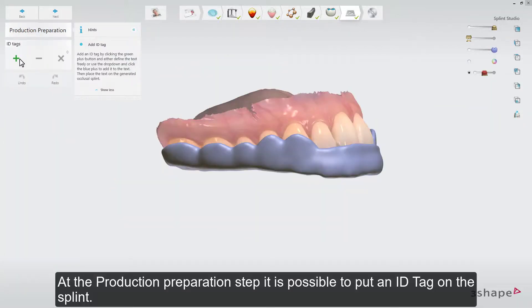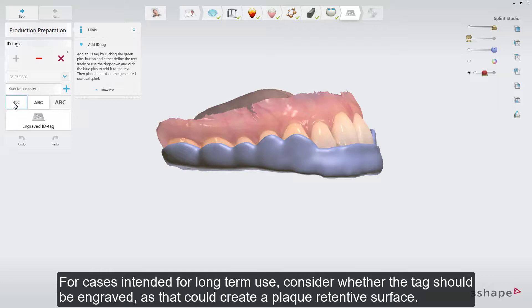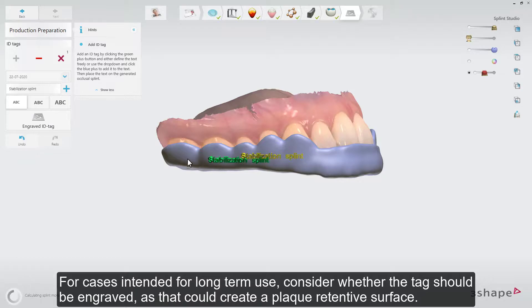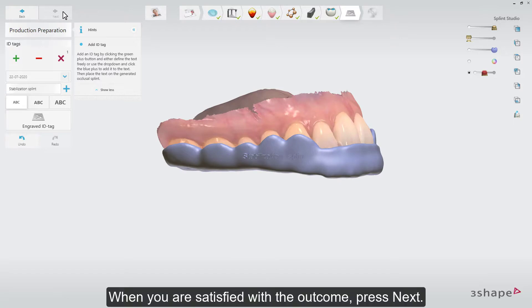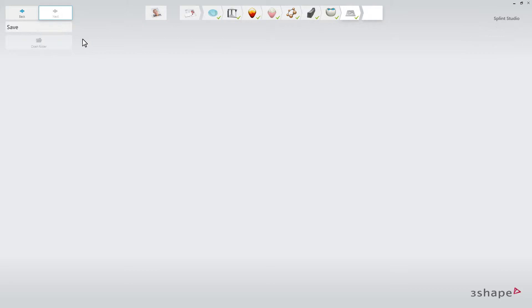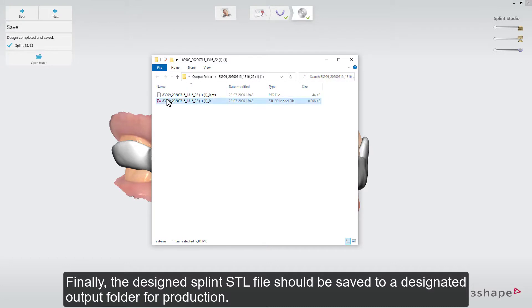At the Production Preparation step, it is possible to put an ID tag on the splint. For cases intended for long-term use, consider whether the tag should be engraved, as that could create a plaque-retentive surface. When you are satisfied with the outcome, press Next. Finally, the design splint .stl file should be saved to a designated output folder for production.